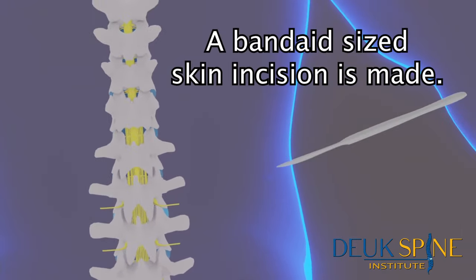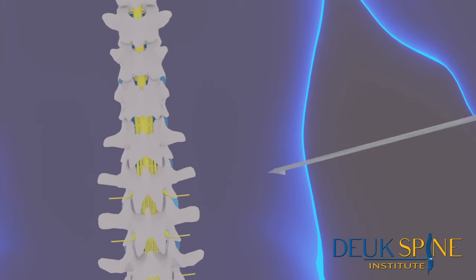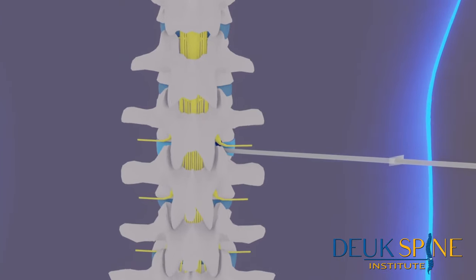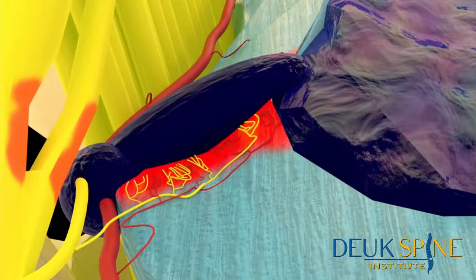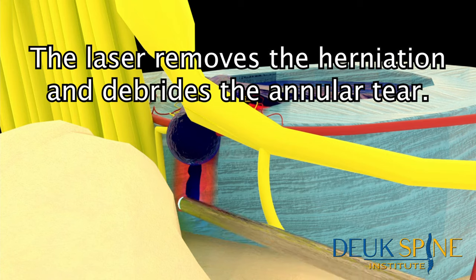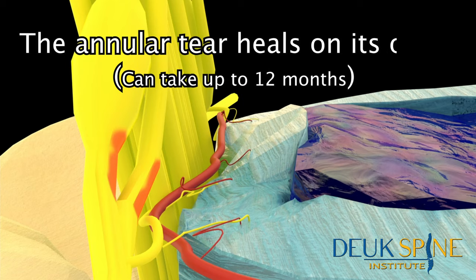A band-aid sized skin incision is made, and a small tube is inserted without damaging the bone or soft tissues. The laser removes the herniation and debrides the annular tear, which then heals on its own.